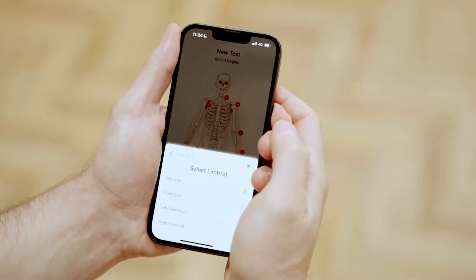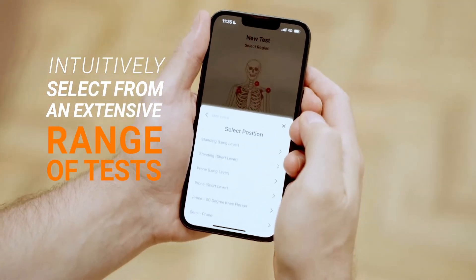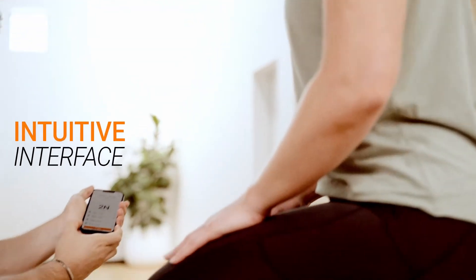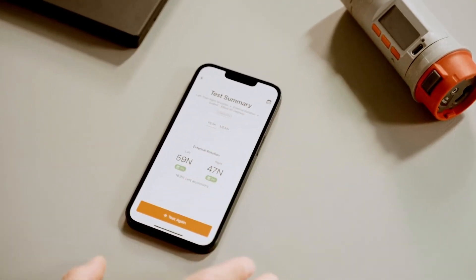Once Dynamo is configured to your requirements, the Dynamo app allows you to intuitively select from an extensive range of tests, along with automatic rep detection and a range of configurable settings. The Dynamo app features an intuitive interface for both you and your client, with easy-to-read results and engaging real-time readouts for strength and range of motion.